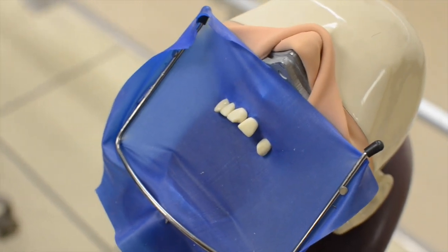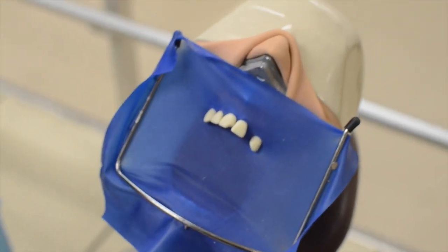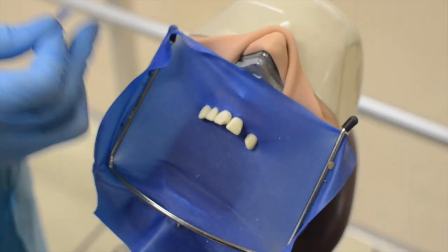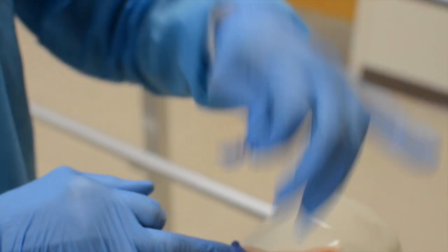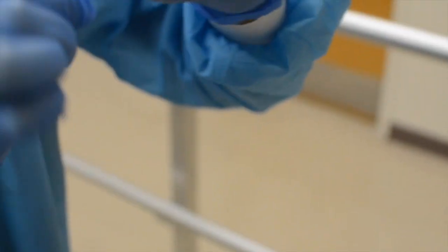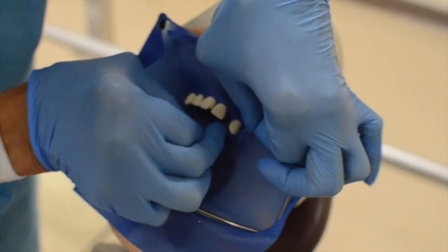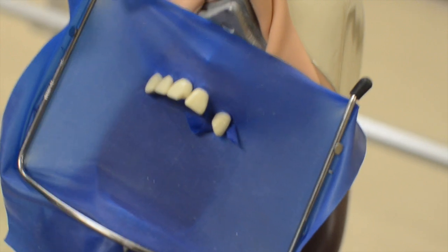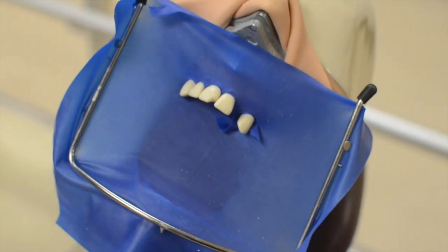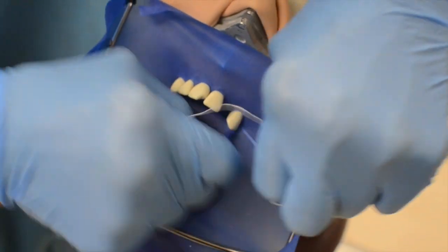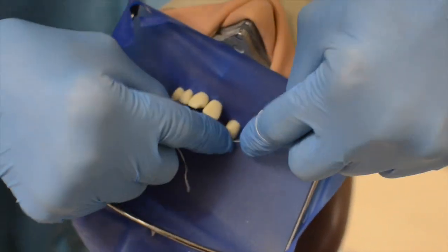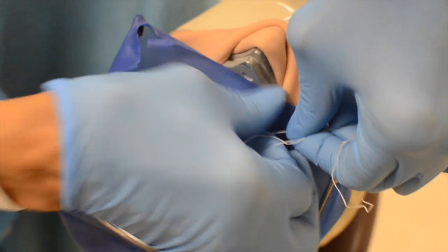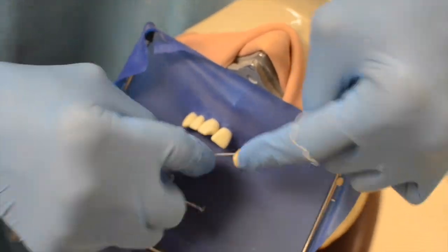But in a patient, sometimes you need a little help in keeping this rubber dam up without a clamp. Look what you can do. You can cut. See, I cut a little piece of the rubber dam there. You can cut this rubber dam, and then take that interproximally, and your rubber dam will stay up quite nice. Another alternative is to use a piece of dental floss.